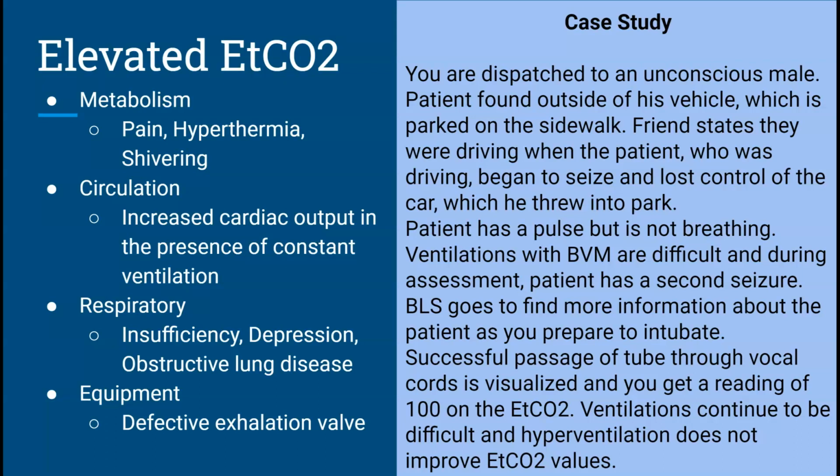Nicole, I put it in the chat: if that spike in CO2 happens when you regain ROSC, would it just be a quick spike, or would it remain consistent? It'll remain consistent. You'll be doing CPR, and the patient's maybe at 12 or something, right? And then you shock and you give an epi, and all of a sudden they'll go up to like 35, 50, something significantly different than where you started, and it'll stay there. That's pretty much saying, hey, the heart is back, it's maintaining a blood pressure, like you're doing what you're supposed to do. It's a very good sign that the patient has return of pulses. Cool.